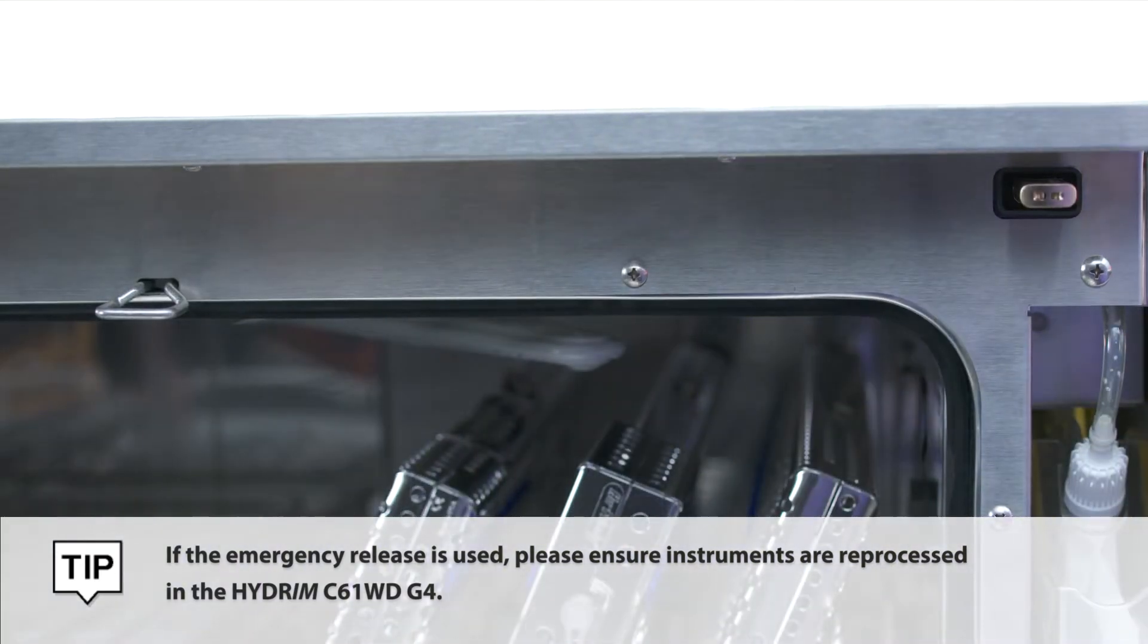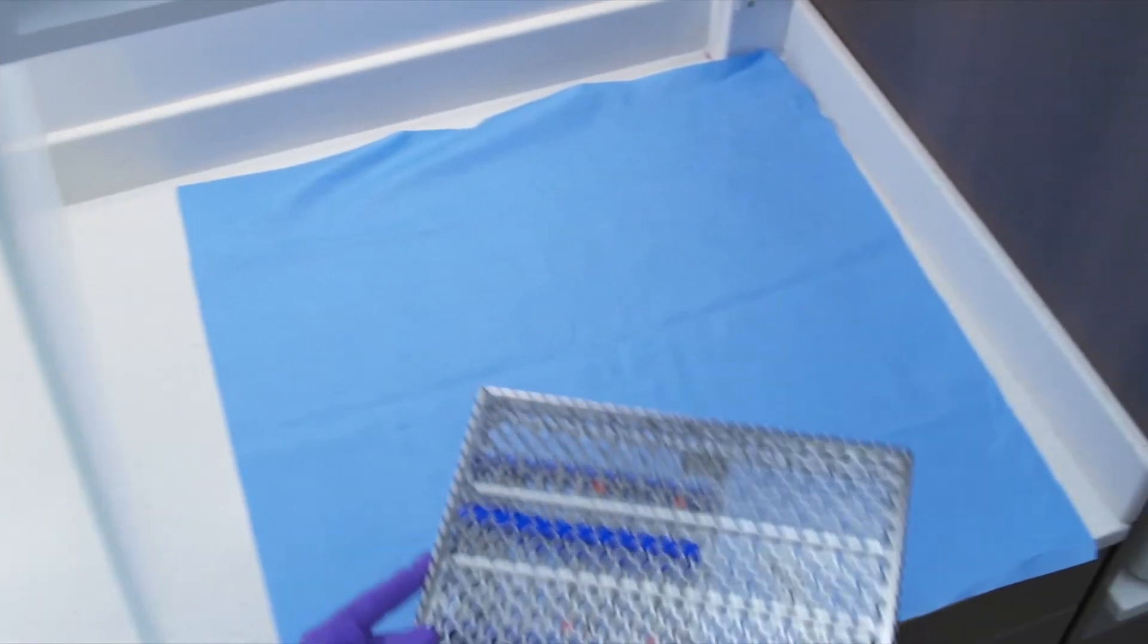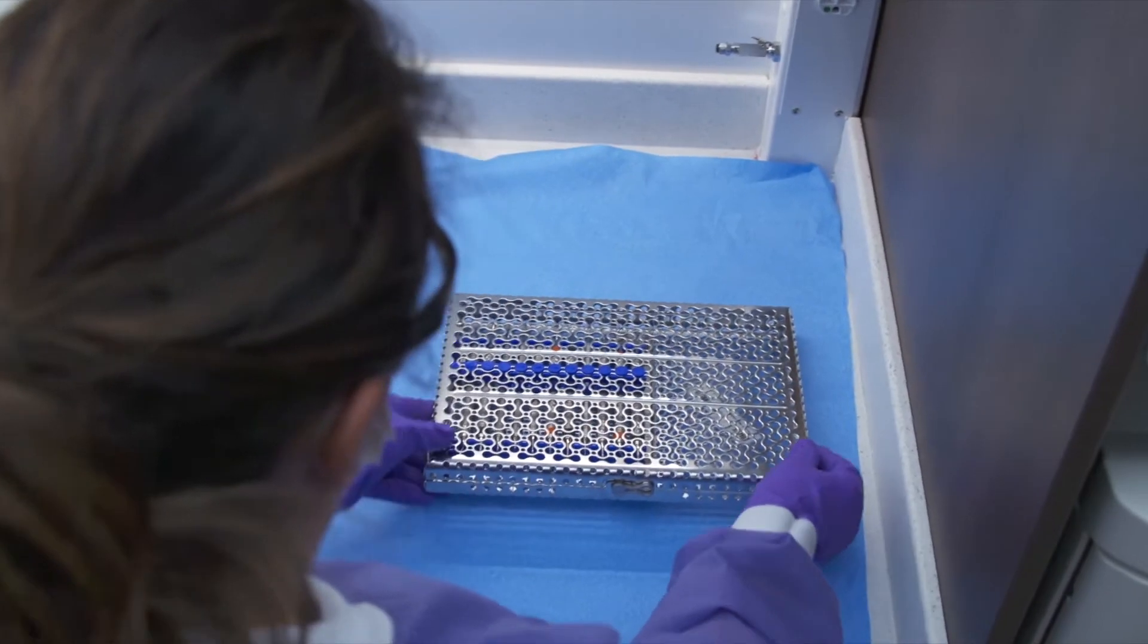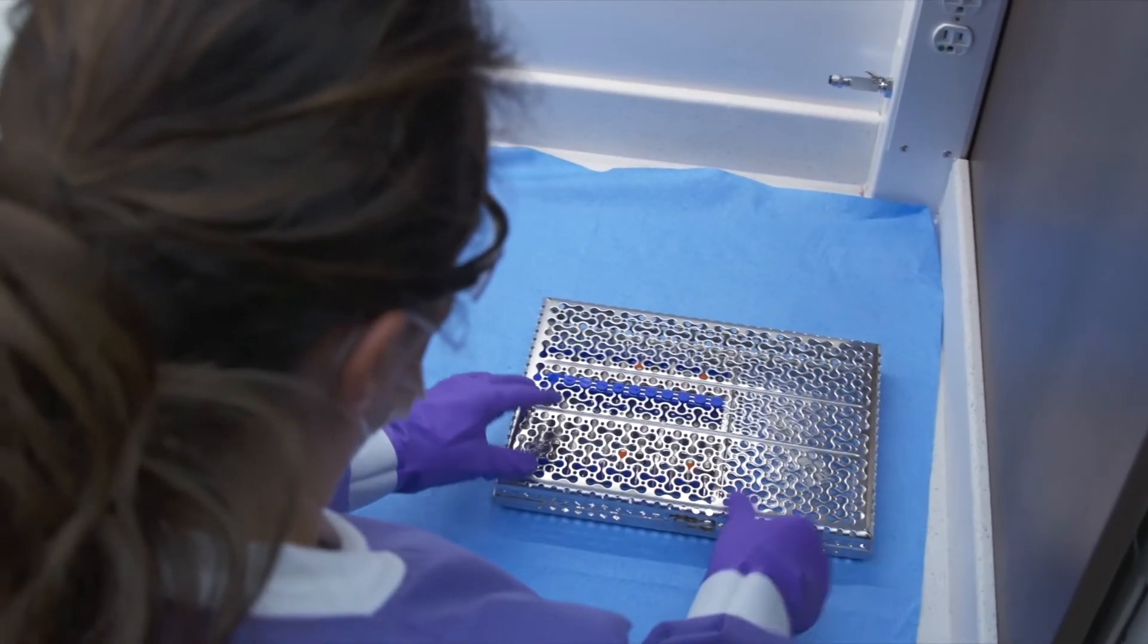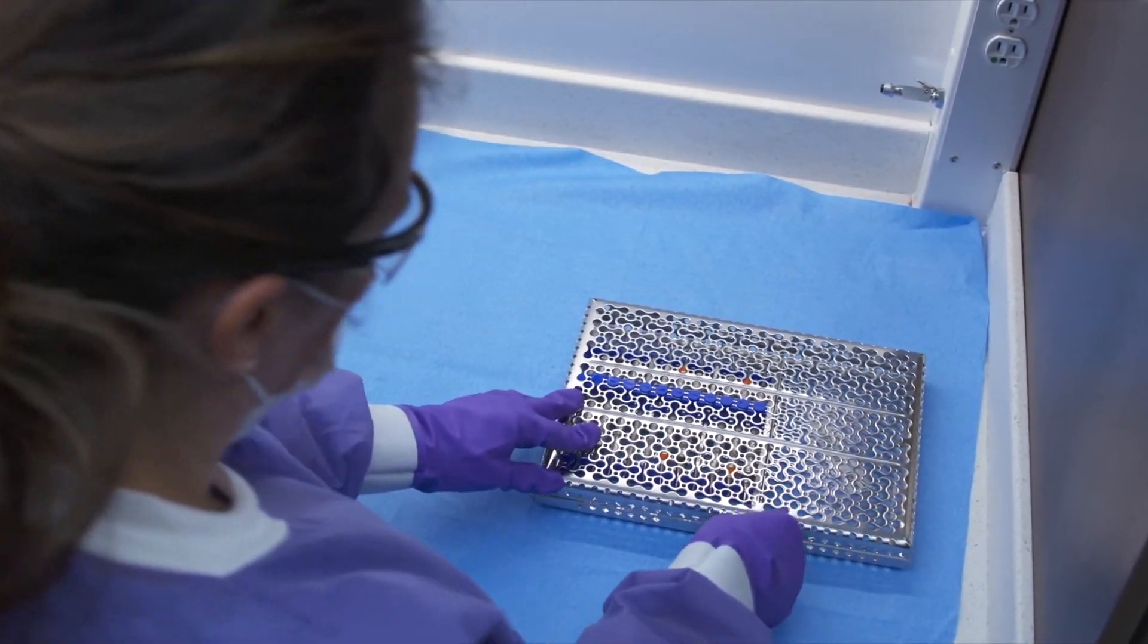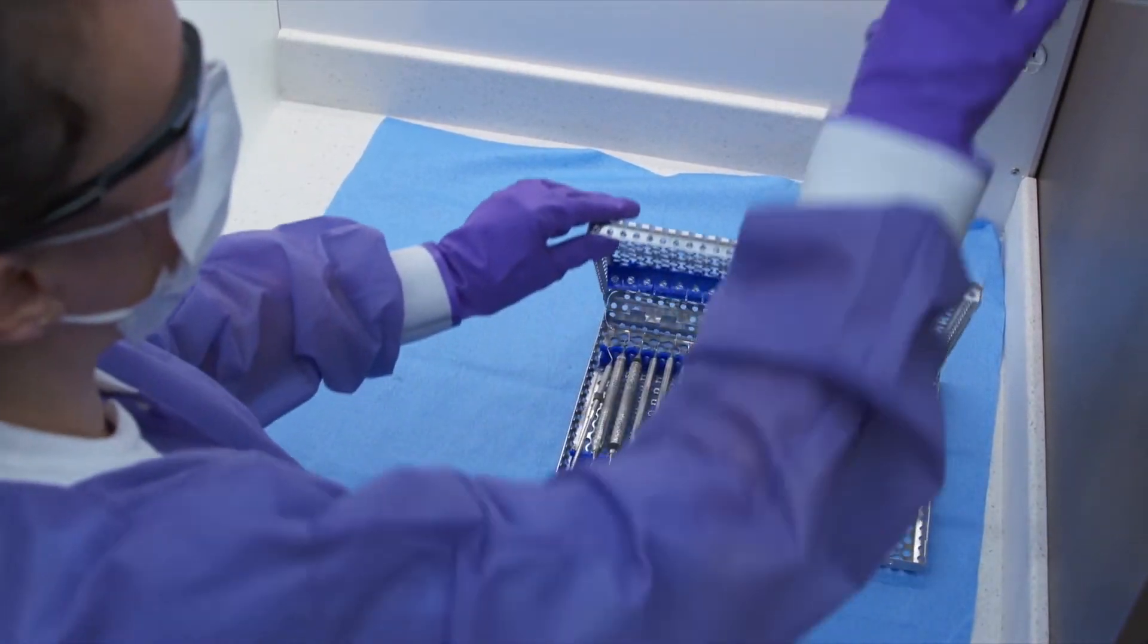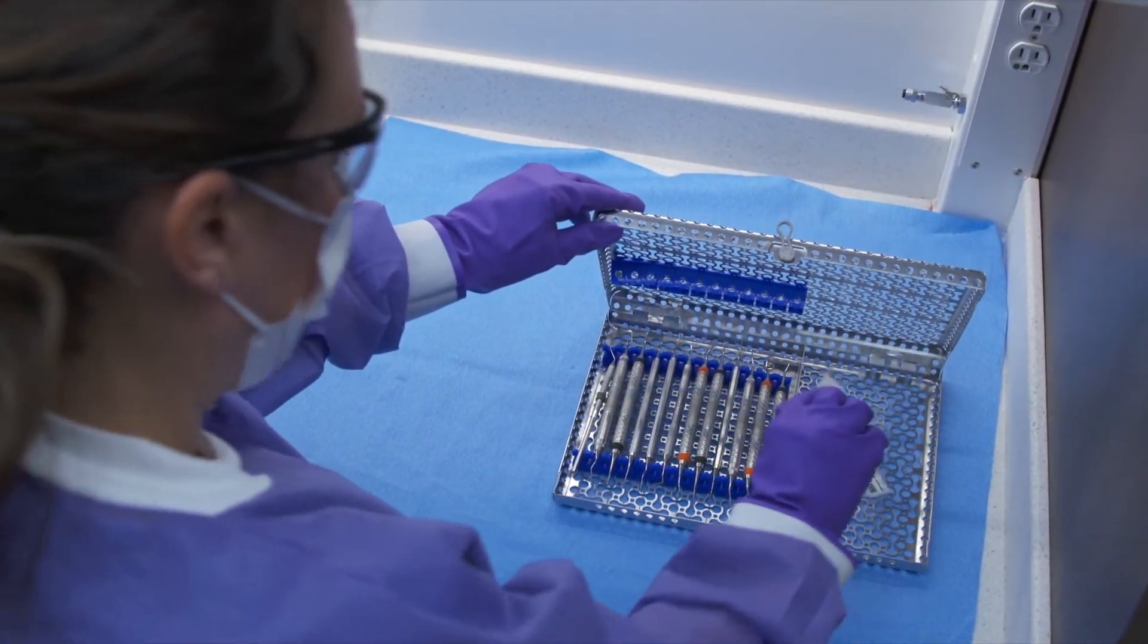The instruments are now washed and disinfected successfully and ready to be pouched or wrapped for sterilization in Statim or Bravo.